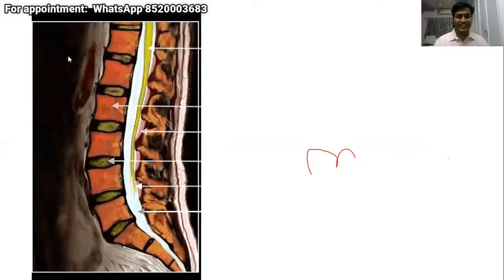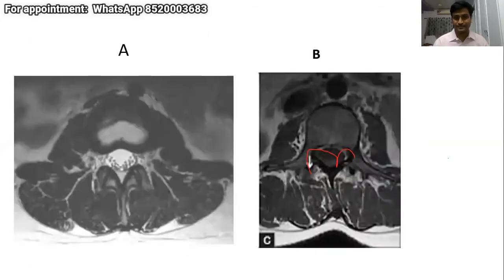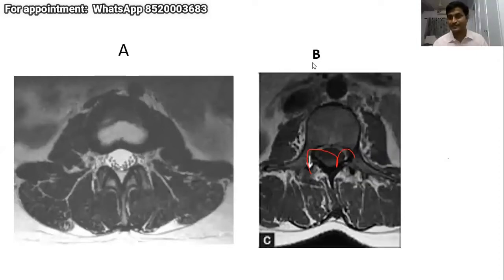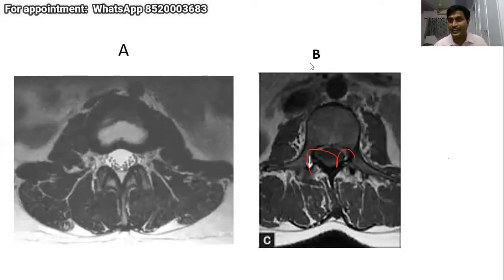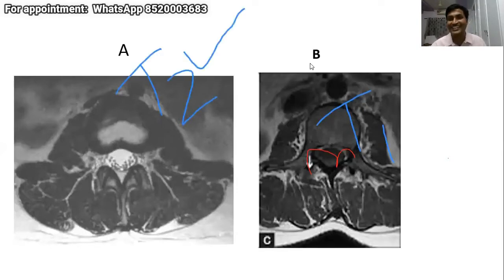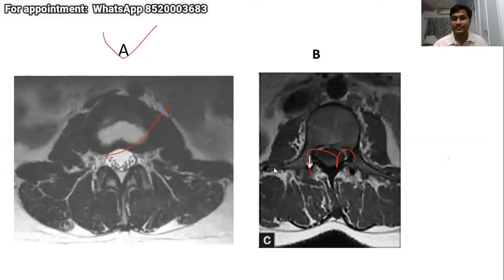Comparing two MRI cuts labeled A and B, a student correctly identifies that B is T1 and A is T2 because CSF is white in T2. The instructor confirms he will always look at T2 cuts. He instructs participants not to annotate the screen until asked, as annotations prevent the screen from moving.